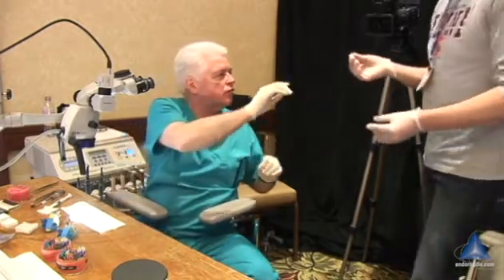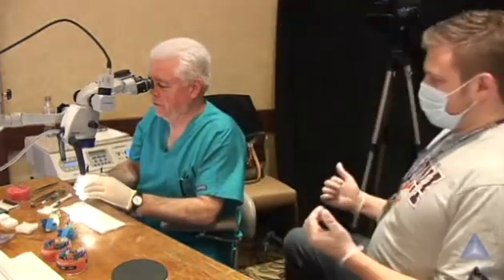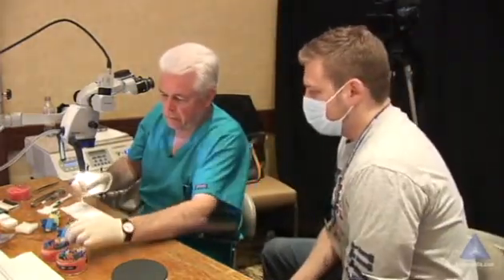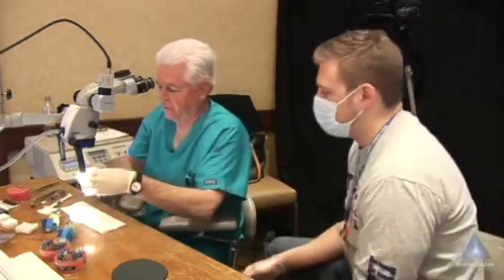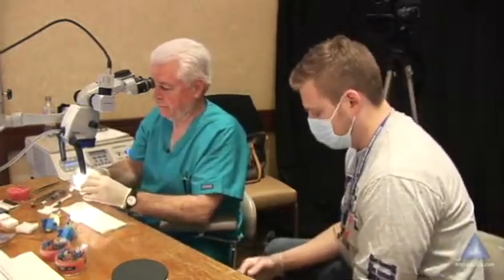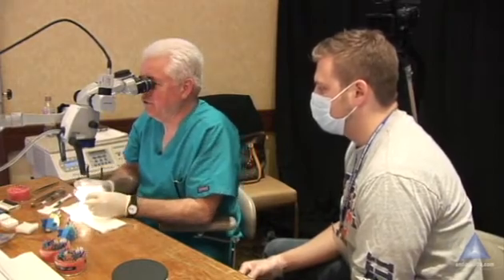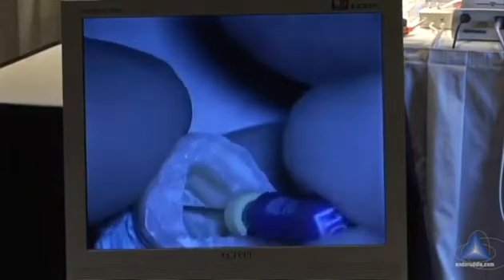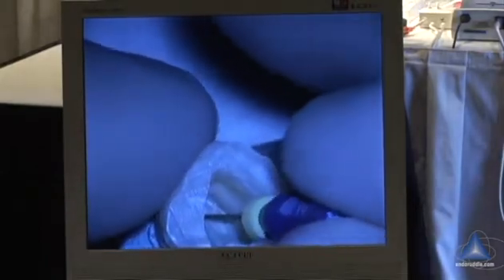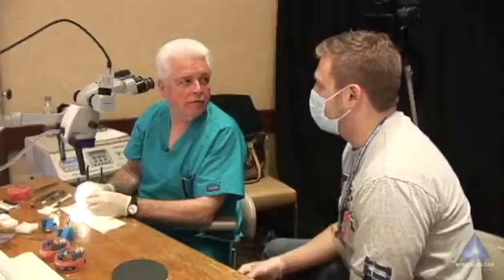I know you don't want me to — I won't do much. That's like my best one I got. Well, then we don't want to do it. But here, I'm going to loan you this. I like shorter instruments. I just want to feel what you're feeling. Are you in the two? I was in the MB-1. So your point is, what if it... I wasn't feeling it, I was just saying — if, if. You were playing like, what if?